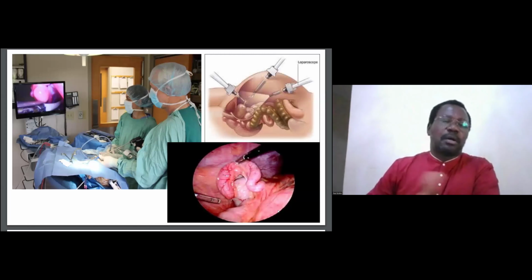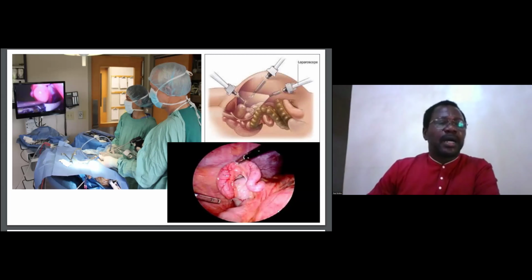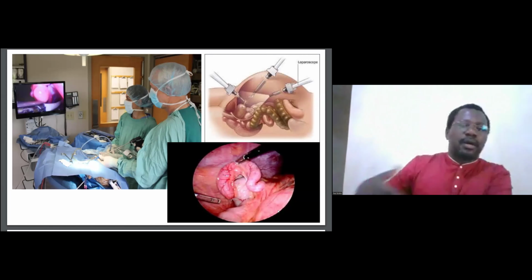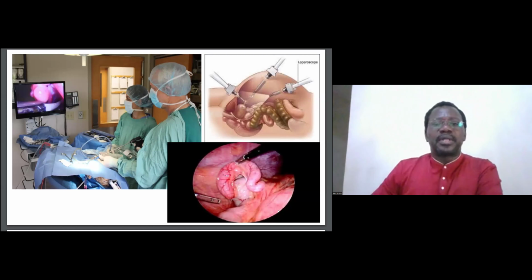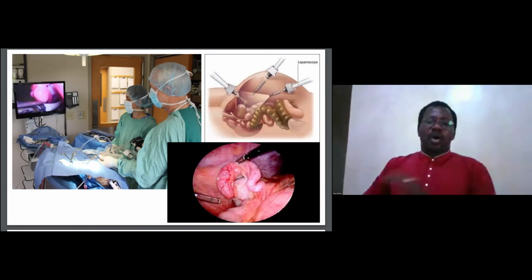So this is the real deal, or this is how laparoscopy in action is. This guy's on the left. Although they are working on this animal lying down there, the image is captured on that screen, and so you can just wiggle and go around. The sketch up here tries to show the laparoscope there and then the other instruments there. So this is the beauty of laparoscopy. You don't open the animal, but you're doing surgery as if you are inside.